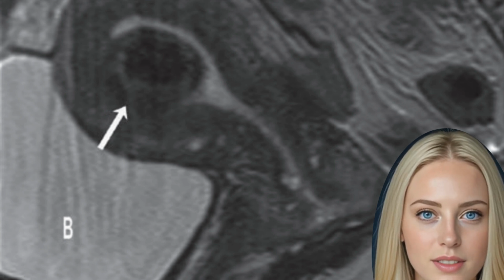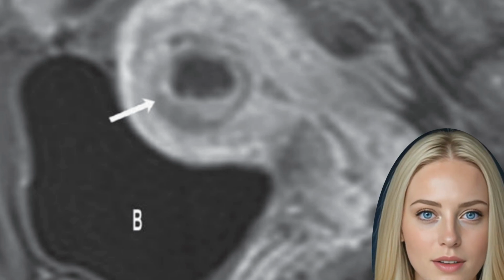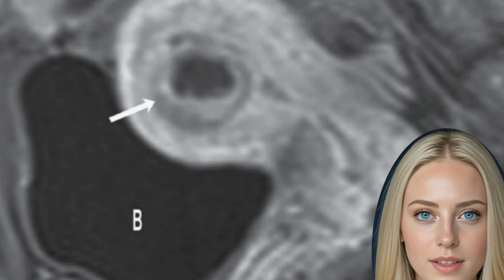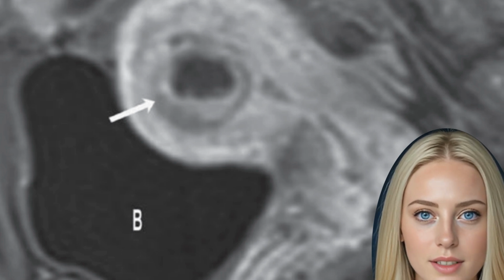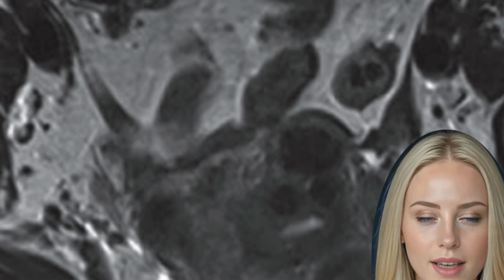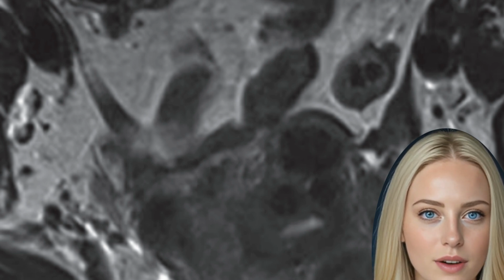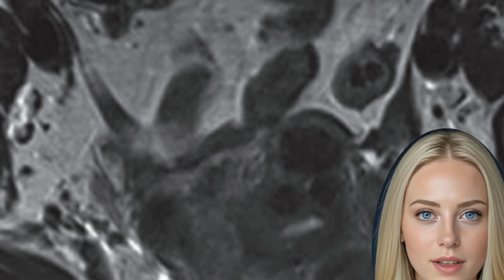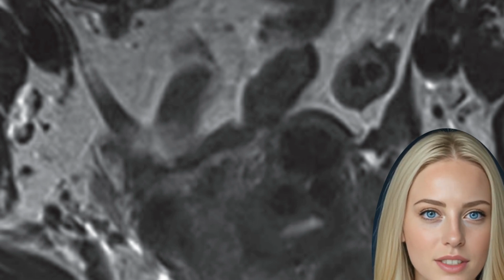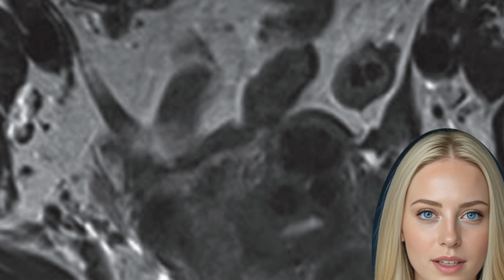The accuracy using ultrasound was reported by Bazot et al. with 88%, and a sensitivity of 65%, a specificity of 97.5%, a PPV of 93% and a NPV of 89% when combining transvaginal and transabdominal ultrasound in patients without associated uterine disorders. 18. However, in patients with accompanied uterine disorders, e.g. leiomyomas, or with an enlarged uterus, ultrasound is limited. Incorrect diagnosis of adenomyosis. 18.